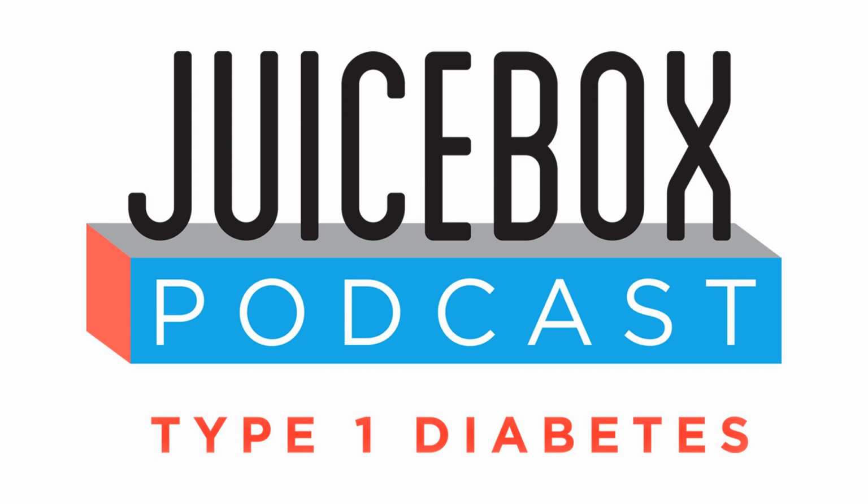So why do I care? What's the biggest difference between Dexcom and Libre? Is that Dexcom has interoperability with all these pumps? Is that correct? Outside of, like you just said, the Libre 2 Plus has interoperability, obviously, with the X2 system and Control IQ. Outside of that, there are no others. Again, we'll get to Medtronic, but that's a proprietary type of use.